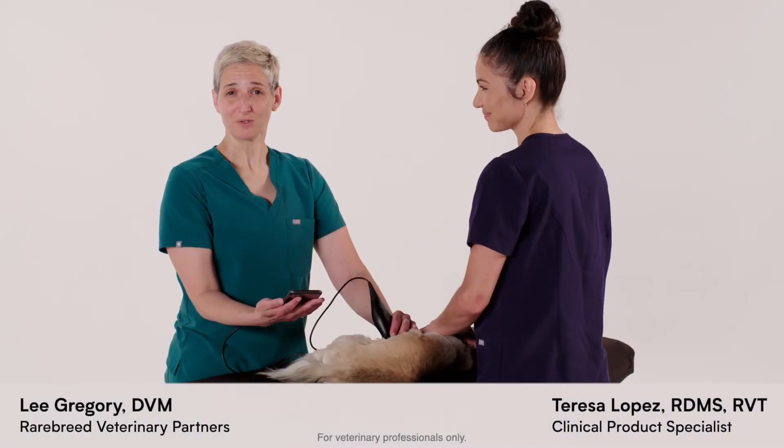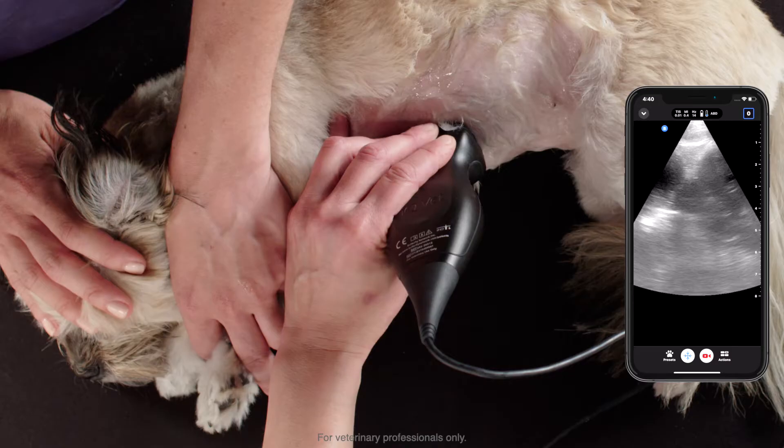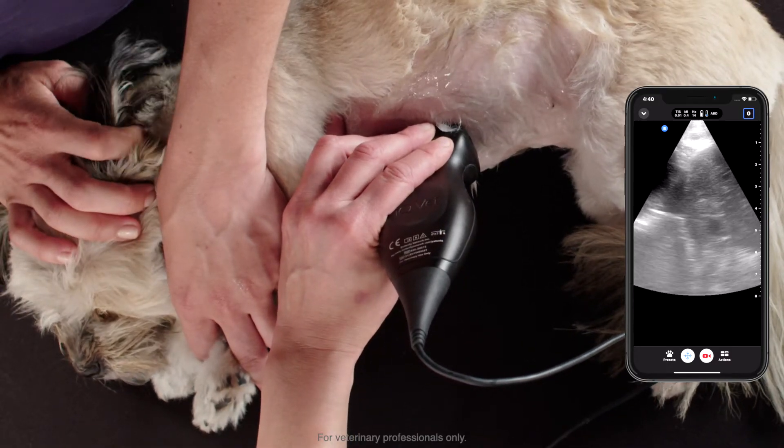I'm Dr. Lee Gregory. We're using Butterfly to perform a limited abdominal ultrasound. We have Luna in right lateral recumbency, which is going to be the most typical positioning.